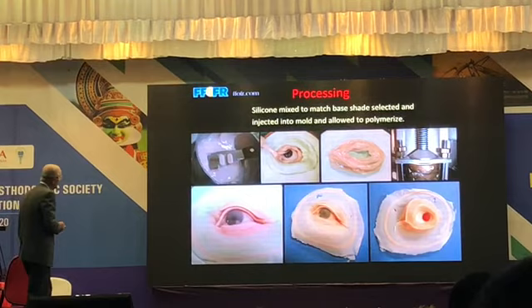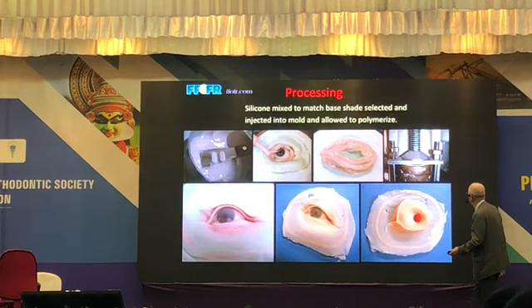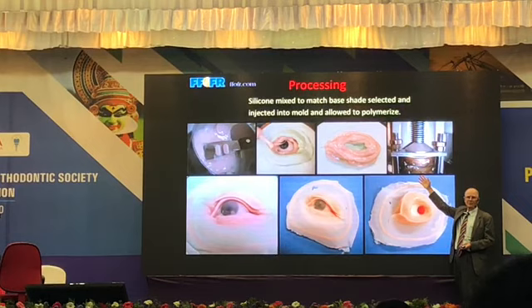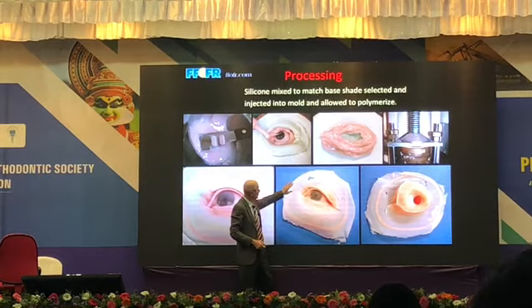So here we just inject into the mold with a disposable syringe, add extra, close the mold. You don't have to put a lot of pressure, you just have to close it. It's not like you're compressing resin or anything. You're just having excess. You have a little reservoir out laterally. See this reservoir out laterally beyond the margins of the appliance? You want to have enough so that it fills the reservoir, so you have no voids.